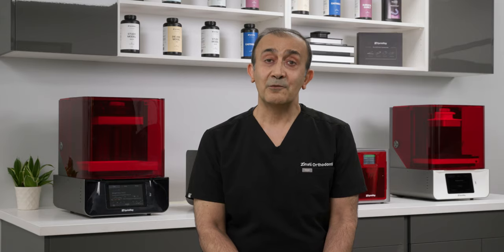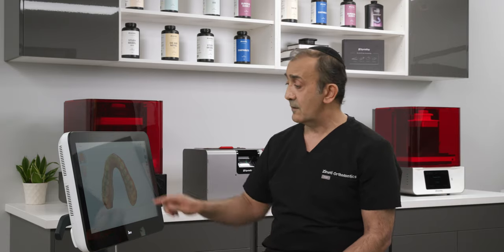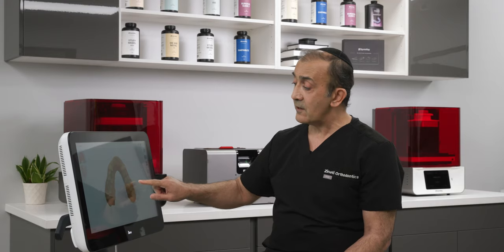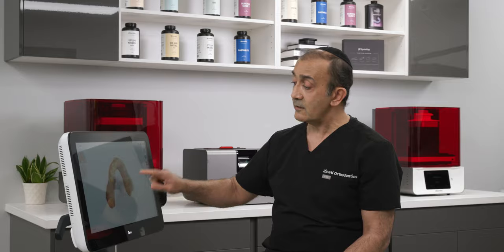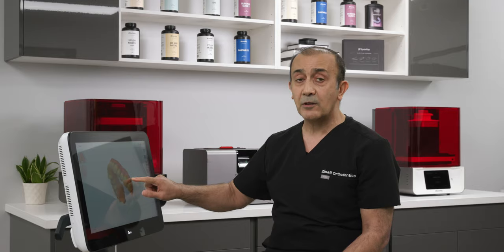I'm excited to share my clear aligner workflow. We start the process by making sure that we have a very good and accurate intraoral scan. It pays to be very picky at this point. I usually have patients brush and floss to make sure there's no food particles between the teeth, and keep an air and water syringe plus a Q-tip handy.